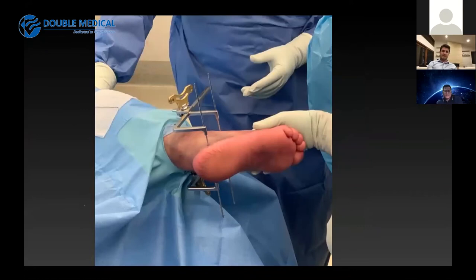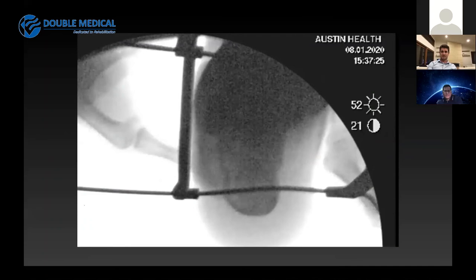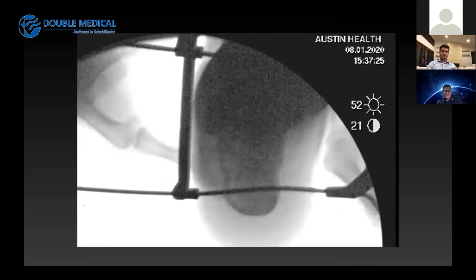The distraction device is placed on both sides of the foot across the two pins, with always more distraction on the medial side until those pins become parallel. As you further increase traction on the pins, it causes the heel to reduce via ligamentotaxis. You can see the displaced lateral wall on this image, and as you apply soft tissue traction via the pins, the lateral wall reduces, the tuberosity position improves, and the varus is restored to a more anatomical position.